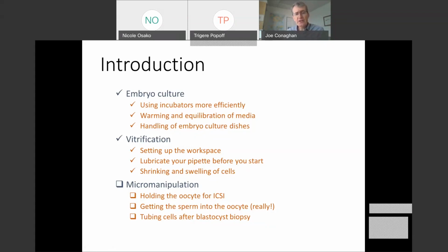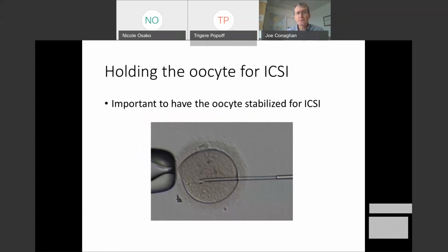All right, third section of my talk is going to be on micromanipulation. And the first thing we're going to talk about is ICSI. Now, some of these tips are really sort of geared towards the young embryologist or embryologists who are just learning ICSI or trying to get better at doing ICSI.